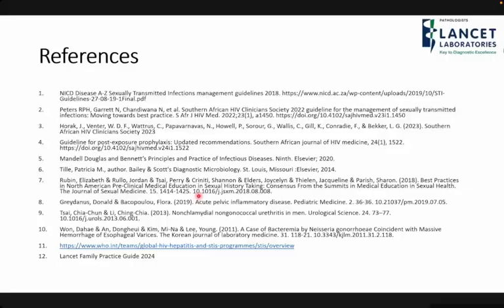So with vaginal discharge syndrome and male urethritis, I'm not sure as to why, but they have found that with males the sensitivity is high with your swabs. I don't know if it's maybe a technique, because with females it's easy with the urethra, that's where everything comes out from. And with the vagina, you have to be very particular on how you are swabbing. So maybe it's the way we swab. And then with urine as well, same thing. With females, urine is not reliable because that's not where you expect to find your gonorrhea. But with males, everything else comes out from the same area. Yeah.